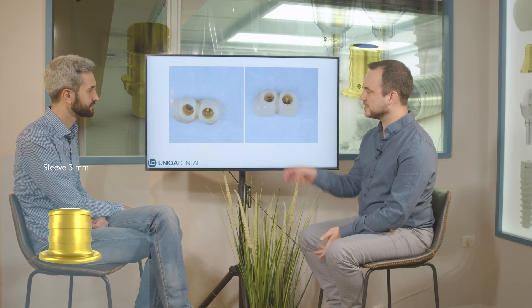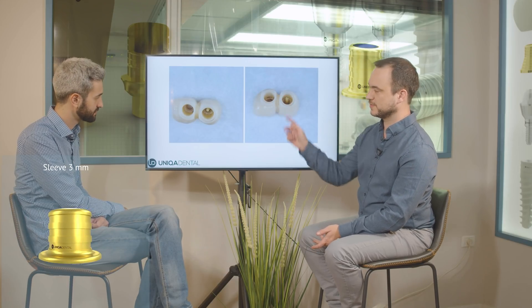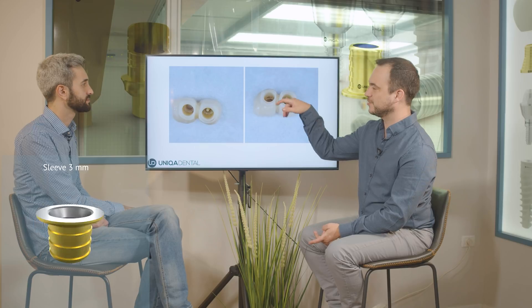They just detached from the sleeves. The cement stayed on the sleeves. You can see that you don't have any residues of cement. You have the composite material that closes the hole, but the sleeves just detached — the crowns just fell down.